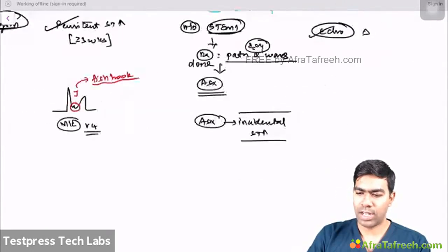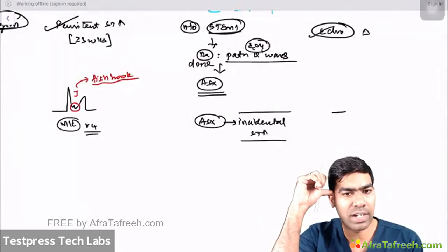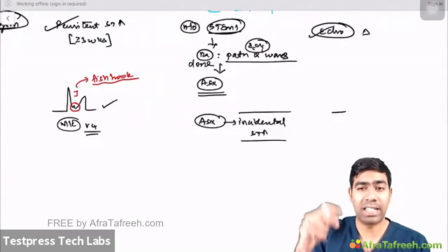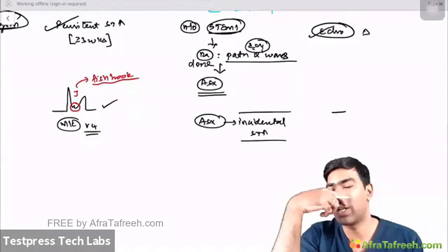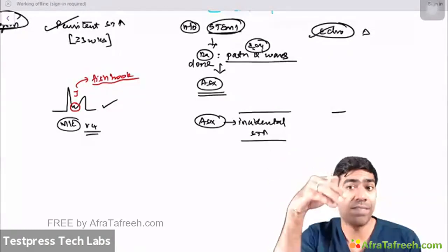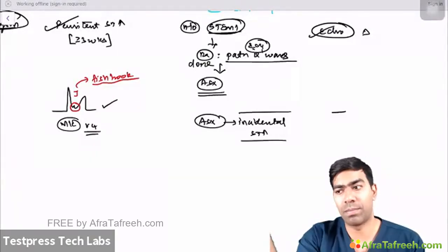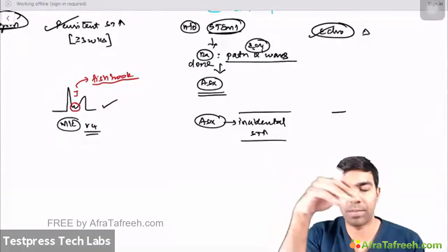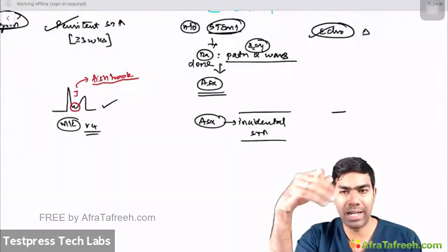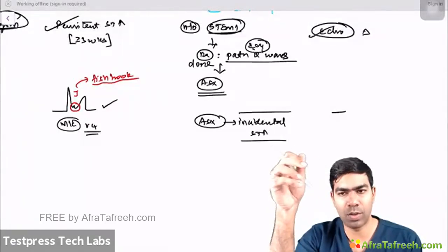And you don't really need any treatment. But remember, there is a Swedish study. In one family they proved that if this ERS is seen in inferior leads, 2, 3, aVF, there is a risk of sudden death. In precordial leads, it's extremely common and it's likely to be benign. But if you see it in inferior leads, there is a risk of sudden death. That's what they have told, but I'm not very sure about that, because that is proved only in Northern European families, and in India I don't know how relevant it is. But in general, we don't give any treatment for that.